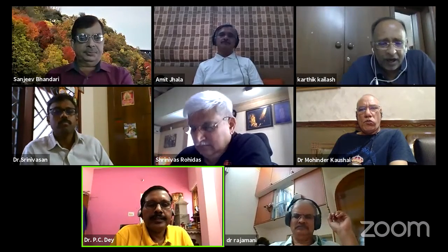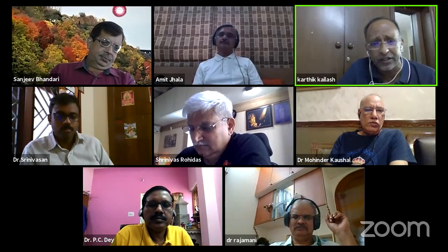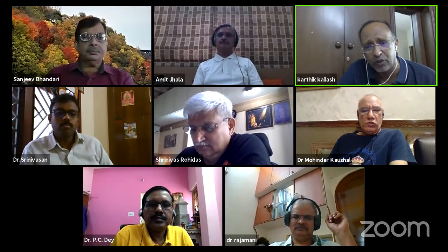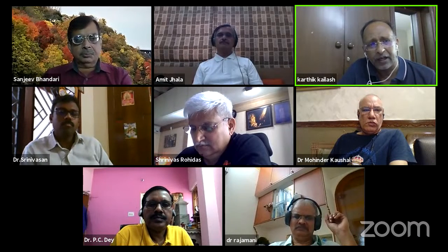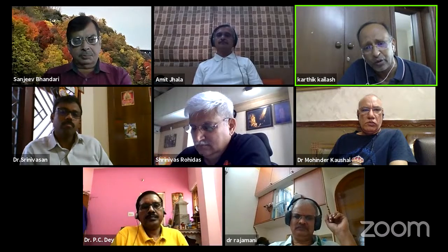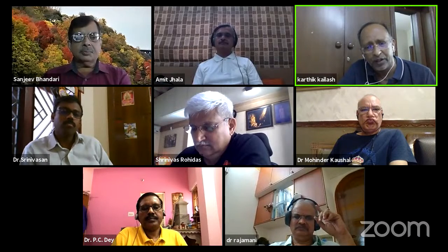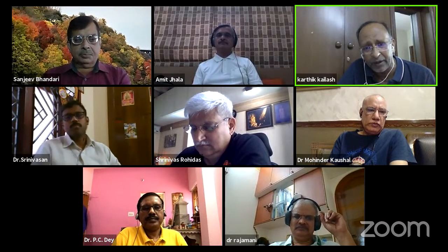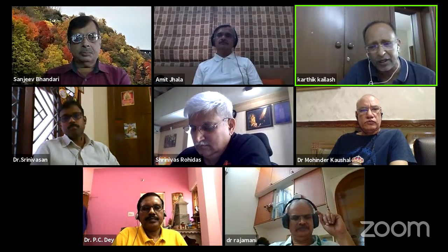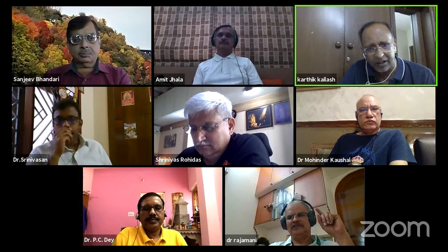Kartik, you go ahead. Yeah, our experience, Amit, has been a little bit different with about 12 or 13 of the cases with the discitis where we have done transforaminal endoscopic debridement, lavage, and washouts. And we find that the patients have had good results with the transforaminal endoscopic lavages following this. And I think it's a very useful procedure because it's done under local anesthesia and we're able to get a good clearance. And we don't have to go necessarily do a fusion. So we have about 12 or 13 of these patients now who are done. And the results have been quite good.